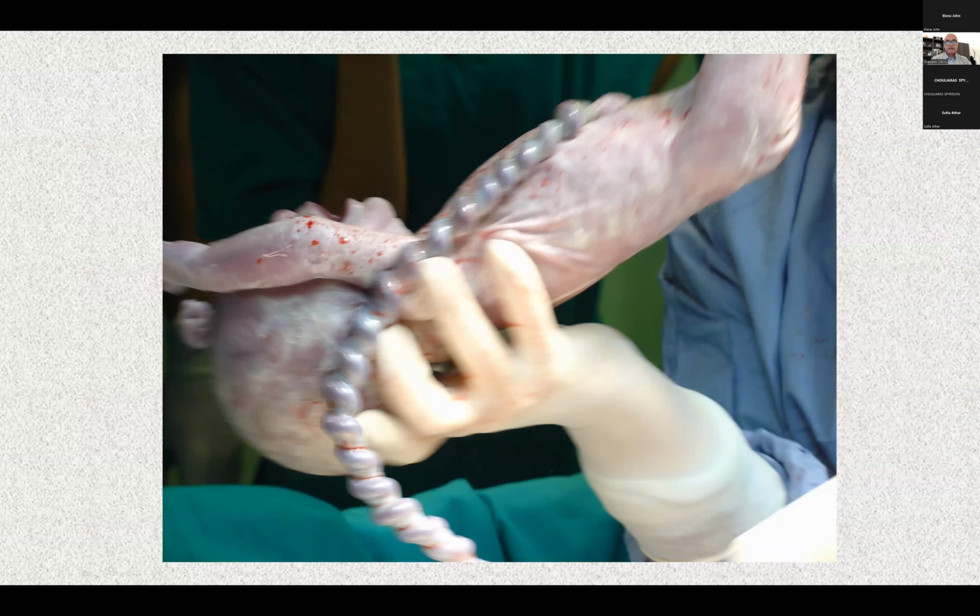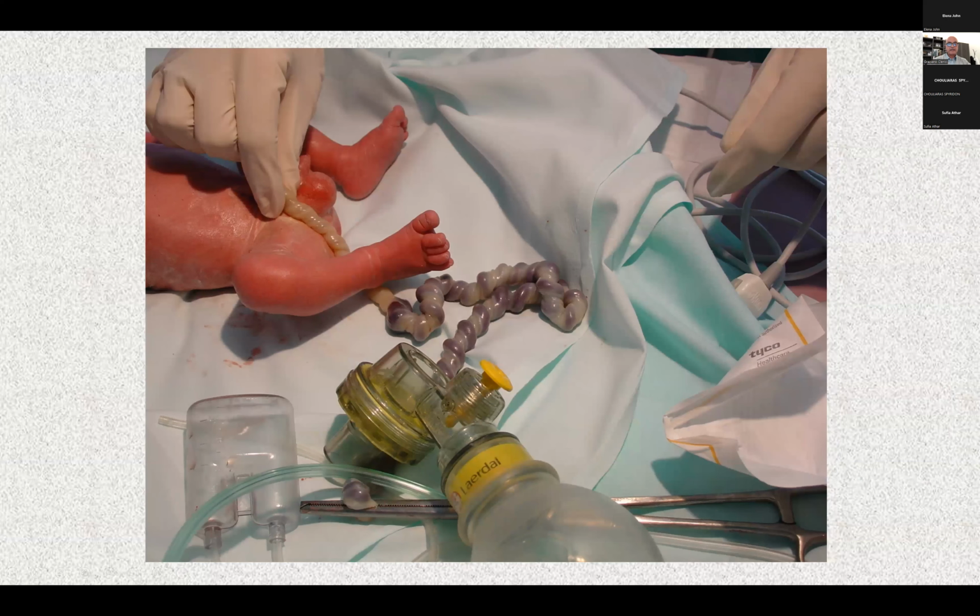And we can see what was the cause: the hypercoiled umbilical cord. You can see here the final part very close to the abdominal insertion is without blood, because it is characterized by very high torsion.